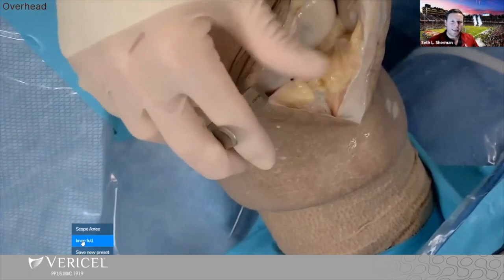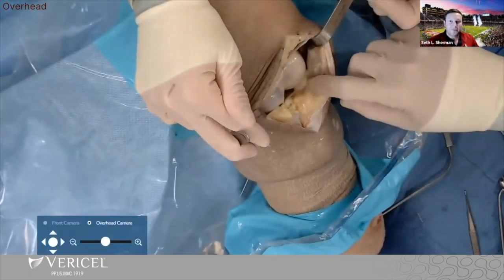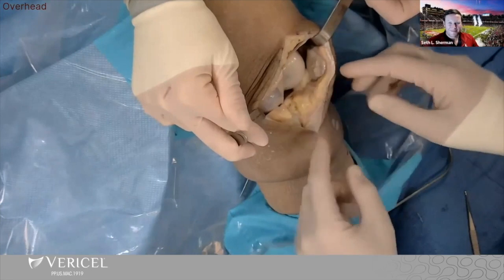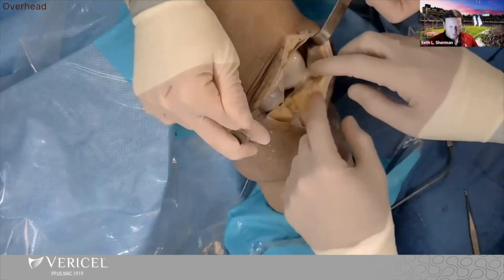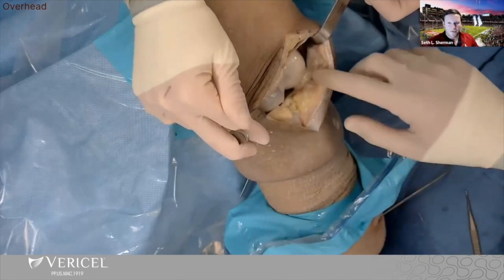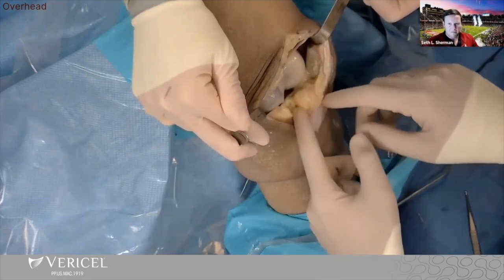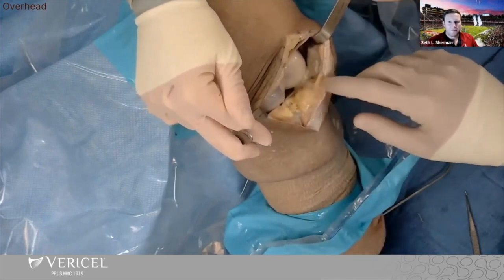I sometimes release the fat pad off the patella side, which gives me more mobility as well. When I do a TTO, I actually now will release the fat pad completely off of the patella and leave it intact, and I found that patients are much less stiff doing that. With this approach it's a little different because I want to make sure I protect the meniscus and get down low for better access. But for those with the TTO, yes, I agree — releasing it completely off the patella is the way to go.